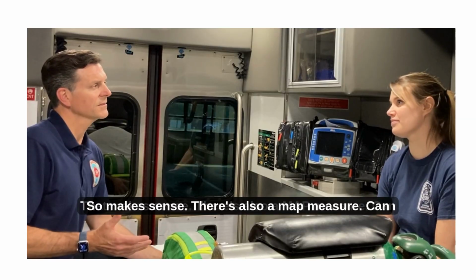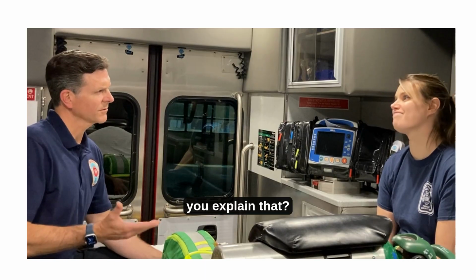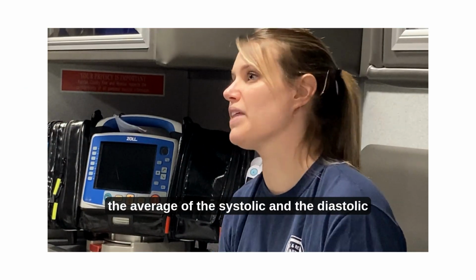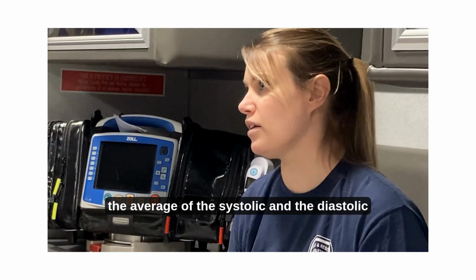So that makes sense. There's also a MAP measure. Can you explain that? So MAP is mean arterial pressure, which is the average of the systolic and the diastolic over each heartbeat.